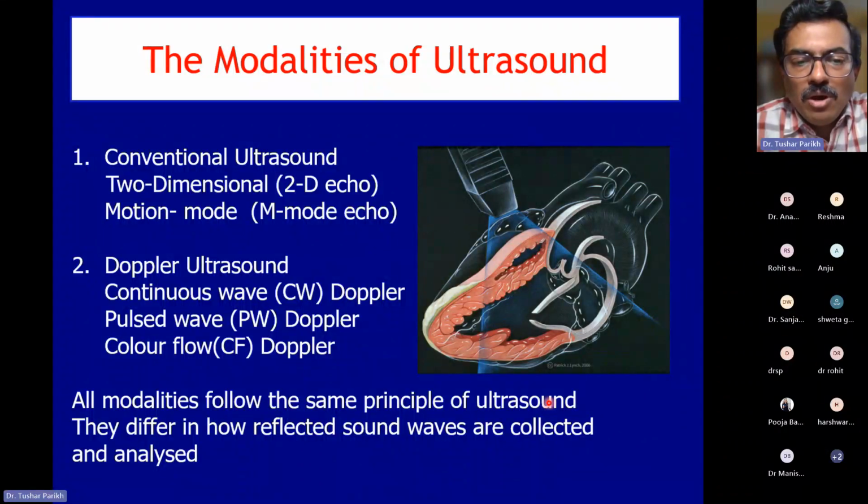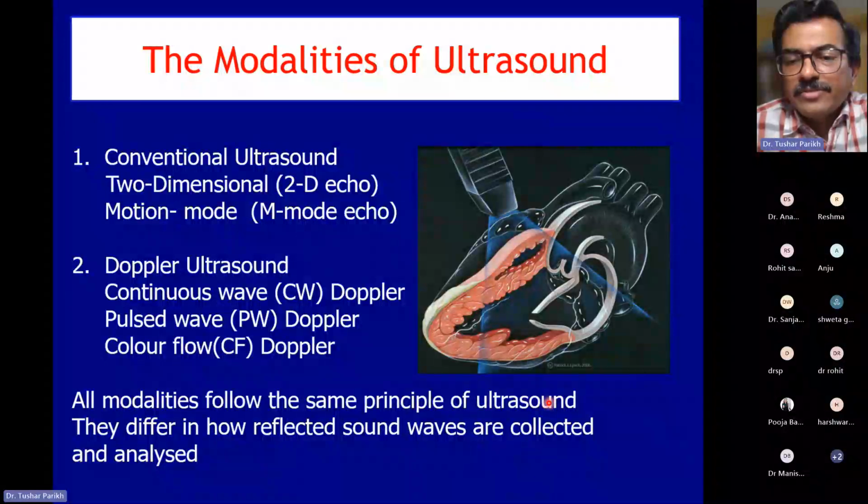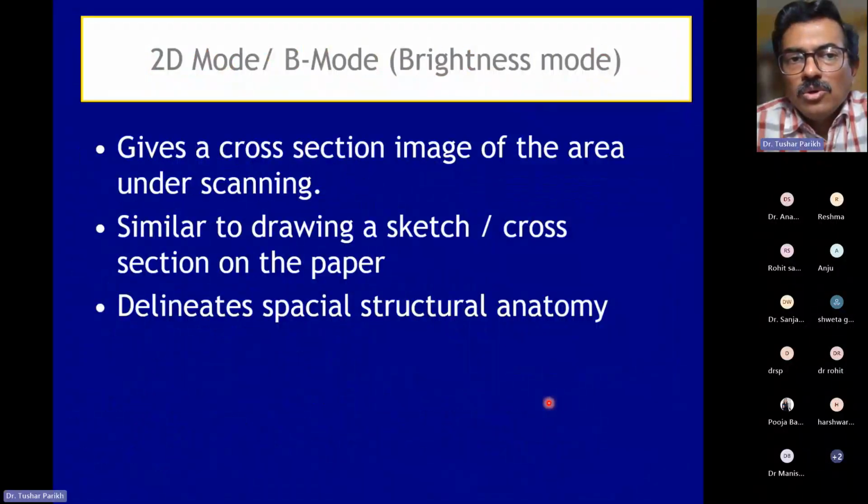Basically, we have to remember that all modalities follow the same principle of ultrasound. That is, it sends a signal inside the body and waits for the returning signal. They differ in how the reflected sound waves are interpreted by the machine. So we'll go one by one.